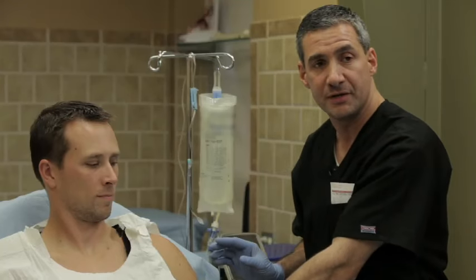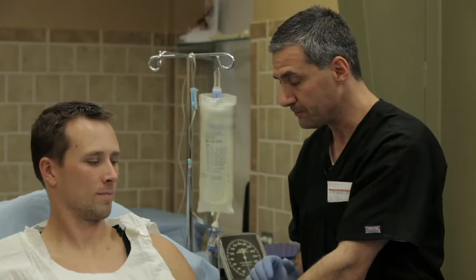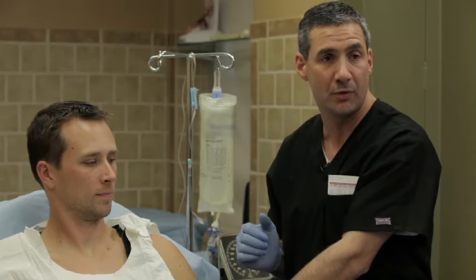The site of insertion is the greater tubercle, which is on the anterolateral aspect of the upper arm. In order to find the proper landmarks, I'm going to go over some techniques that you can use in order to feel the proper bony anatomy.